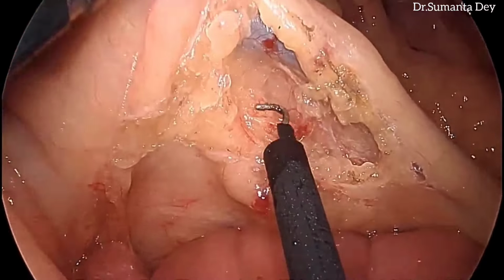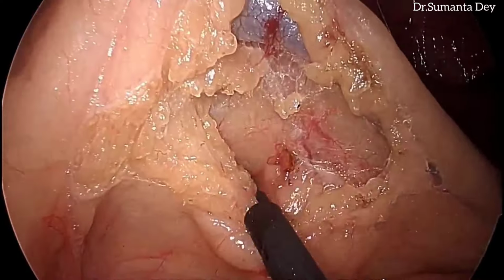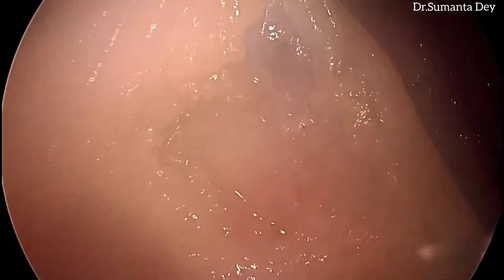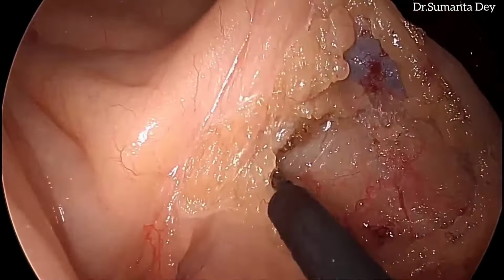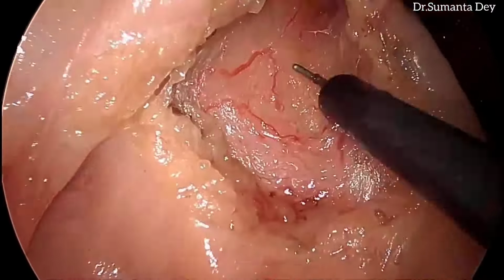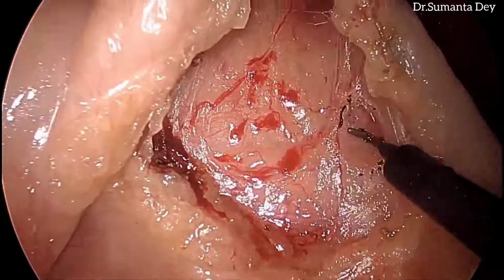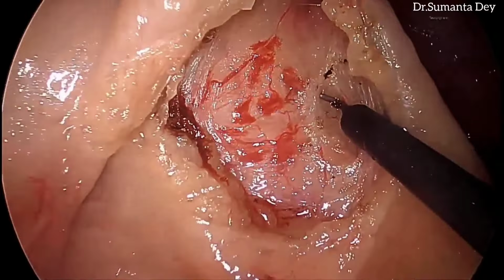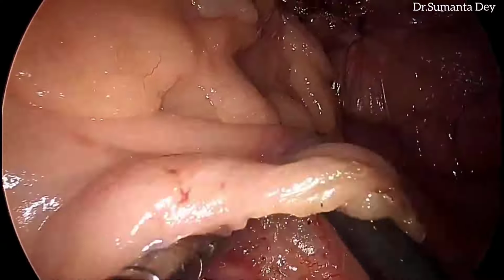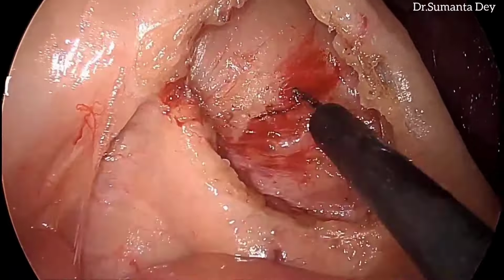So to enter into the CME plane, which lies between the mesocolon and the Gerota's fascia, that plane we have to identify first. Once we identify the plane, a clear plane has been created, and following the embryological plane of dissection without breaching the mesocolon, we can clearly do a complete mesocolic excision following that plane.